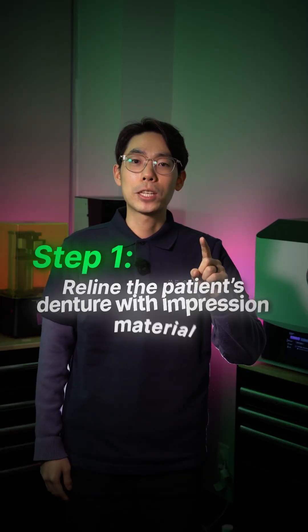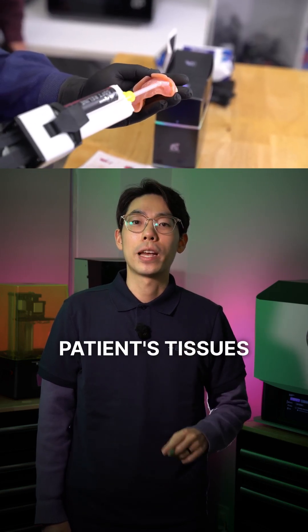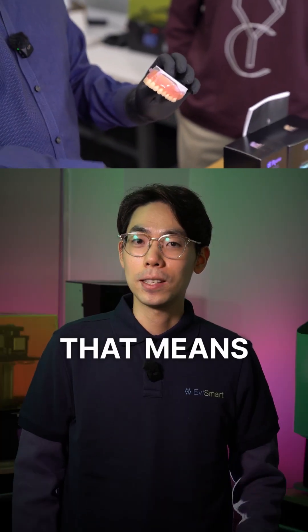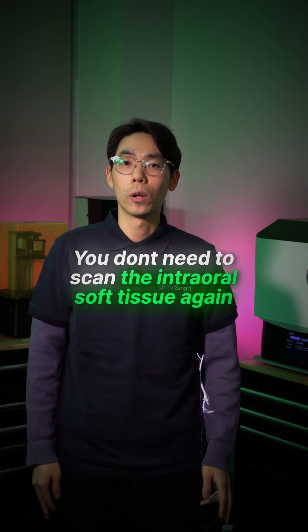Step 1: Reline the patient's denture with impression material. This makes the denture perfectly adapted to the patient's tissues at the time of scanning. That means the denture is the tissue reference up to date, so you don't need to scan the internal soft tissue again.